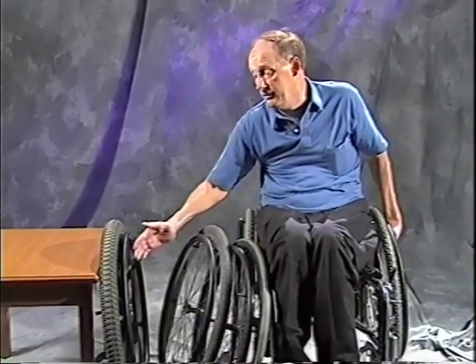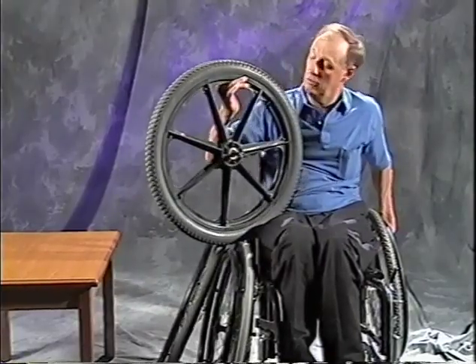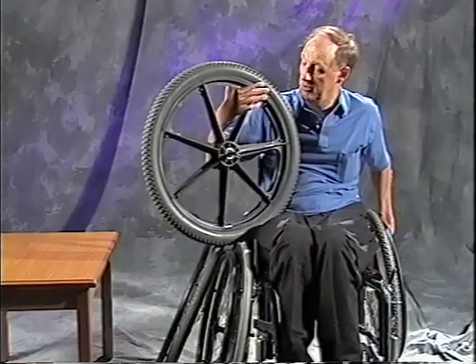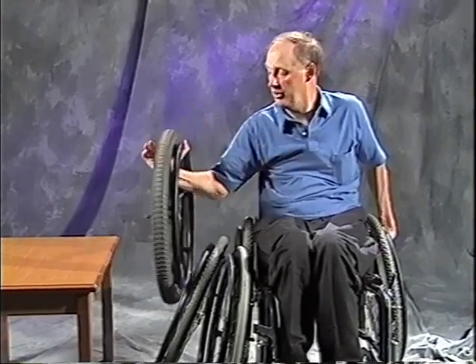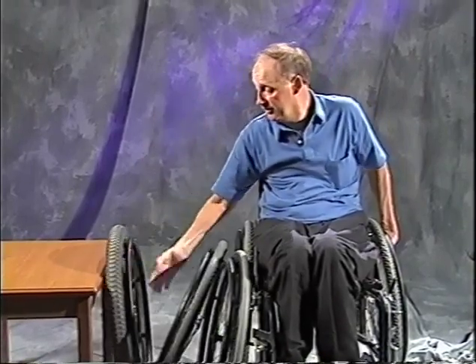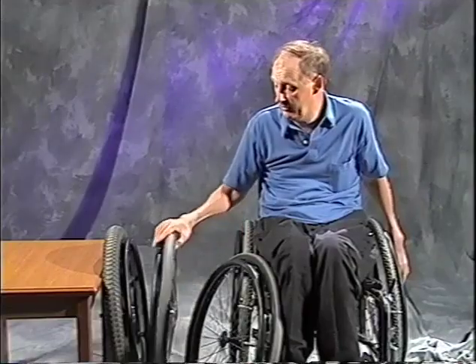When it comes time to pick wheels, you only have about two major choices. One is a spoked wheel, which is fairly light and relatively durable. And then you have the mag wheel, which is a bit heavier, but extremely rugged, and never rusts. So if you want to be off rolling on the beach in salt water, you may want to consider getting the plastic lug type, or if you're in an extremely heavy-duty situation and not concerned about weight. Otherwise, I would just go with a straight spoked wheel.